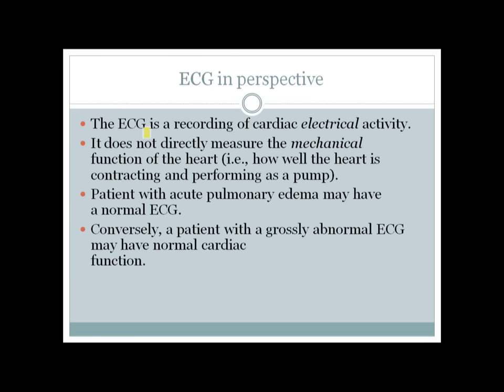So this is a last note. ECG is a recording of cardiac electrical activity. It does not directly measure the mechanical function, so you cannot get any functional idea about the heart, especially how well the heart is pumping. Such as, a patient with acute pulmonary edema may have a normal ECG, or a patient who has a grossly abnormal ECG can have a normal cardiac function.